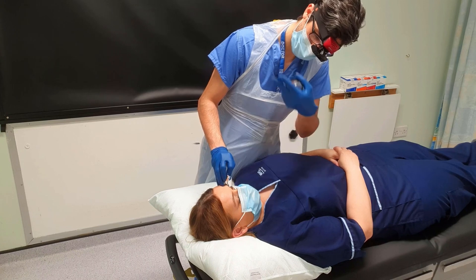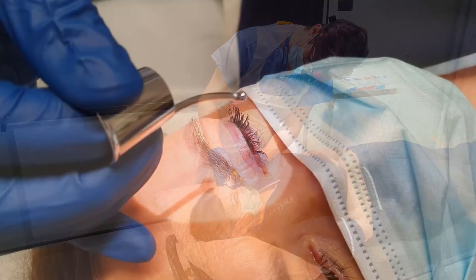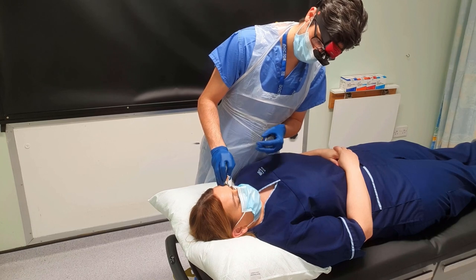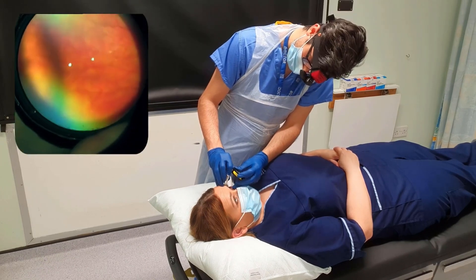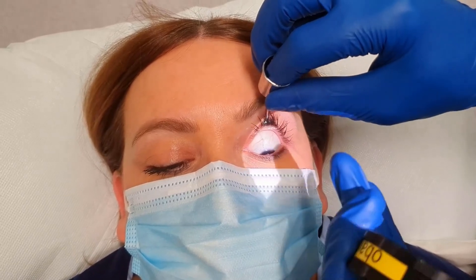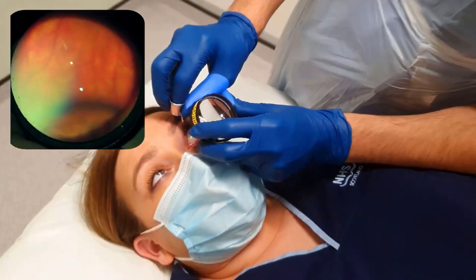With scleral indentation, the BIO can allow visualisation of the far periphery of the retina. This technique brings the anterior retina into view and can be helpful to view the ora serrata and look for peripheral retinal pathology such as anterior retinal tears that would otherwise not be visible on a regular examination. You will require appropriate anaesthetic drops and an indenting instrument, and you should warn the patient that this may be uncomfortable. To perform scleral indentation, position the patient as before. You can indent directly onto the sclera or over the eyelids. Ask the patient to look in the opposite direction to the area to be examined. Allow the indenter to rest tangentially against the area to be indented, then ask the patient to look towards the area to be examined and exert a gentle pressure. This example shows the examination of the superior retina — the patient is asked to look downwards towards their feet, the indenter is then placed on the superior eyelid and rolled, then the patient is asked to look upwards. Only a gentle pressure is required. This is a dynamic examination and the indenter will be moved to observe the peripheral retina.